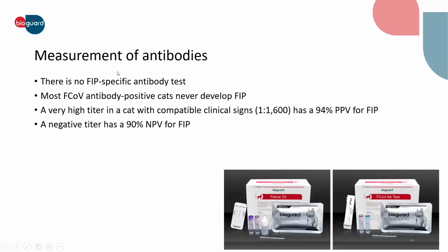And for measuring antibody, although there are some rapid tests that can detect antibody against FCoV, there's no FIP specific antibody test.